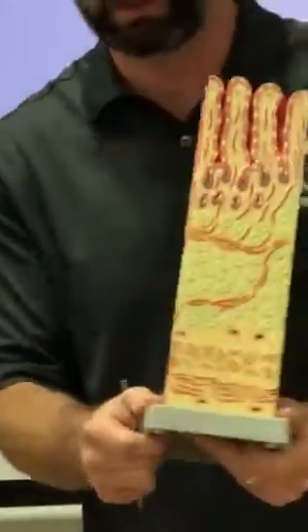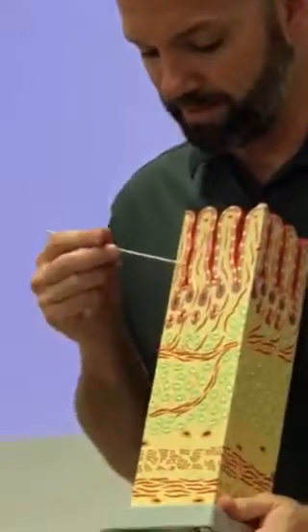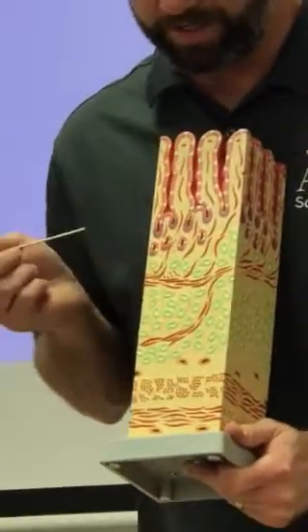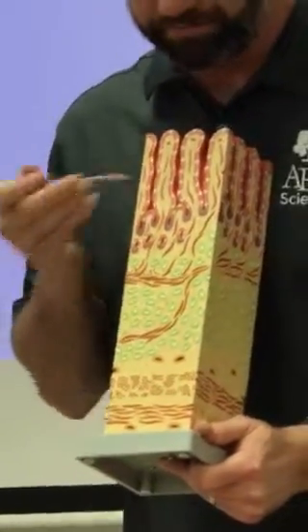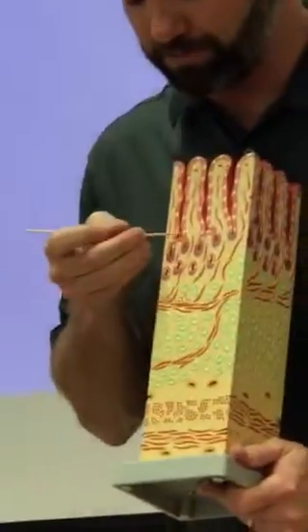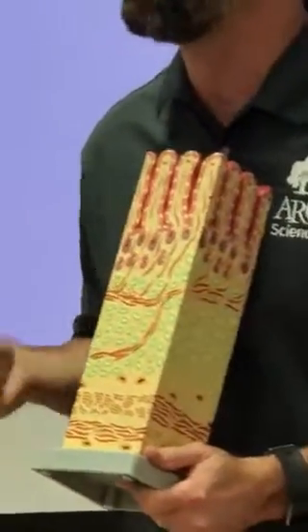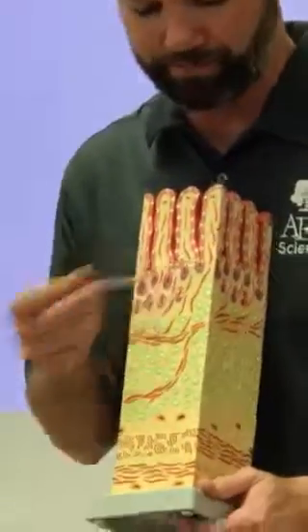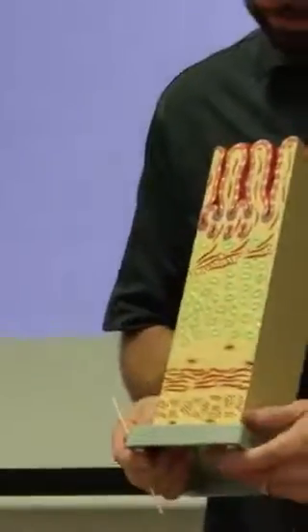There's a second thing that the duodenum and only the duodenum has, which you can see. There's lots of them here. Submucosal glands, called duodenal glands, all of the green. What are the white cells here? Goblet cells. All the other cells? Absorptive cells. Now when you get way down here into the mucosal glands, you're going to find some other cell types like enteroendocrine cells, Paneth cells. And what do we call these mucosal glands down here? Intestinal glands or intestinal crypts.